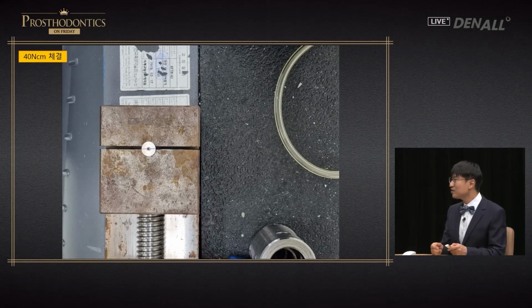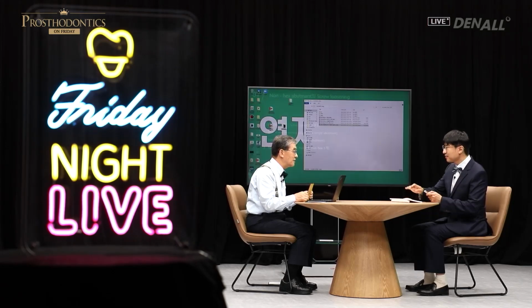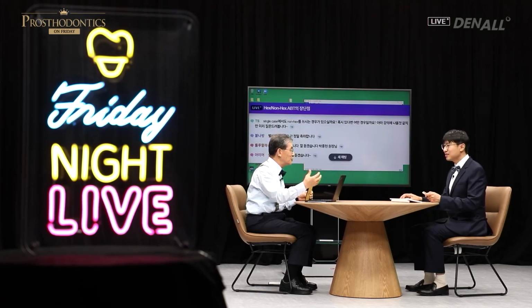In single case, the general method is to use the hex abutment. You can use non-hex abutment for single cases as well, but it requires a bit of know-how and you need to have a lot of expert experience. You need to have more experience.